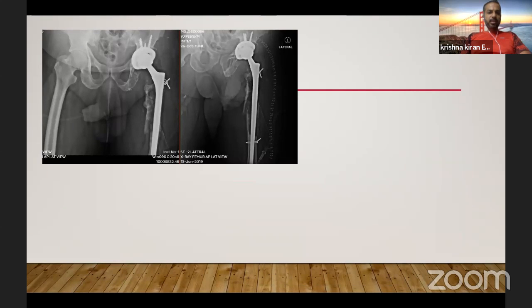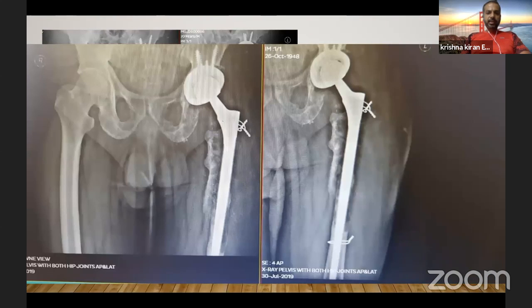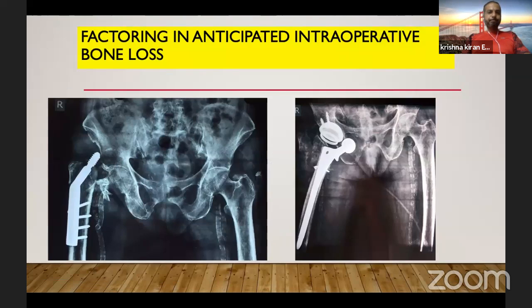And it has been a consistent observation in our practice that with time, the proximal bone reforms with this device. And unlike the solution stem, which can break, this doesn't break. And that's what is happening. That's 3 to 4 months down the line. You can see that the medial bone is reforming. And this patient is a year out now, and is able to walk quite well. And I don't have the latest X-ray, but it is showing a hint of lateral bone reformation as well. So the tube reconstitutes itself once the bone loads in a particular way.